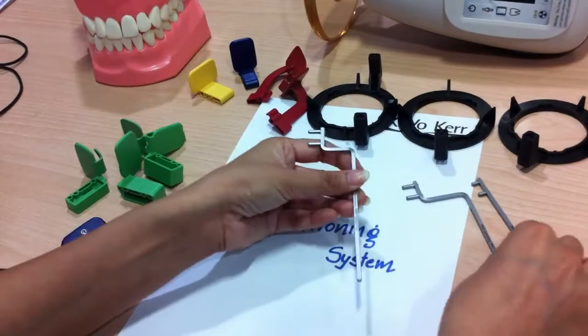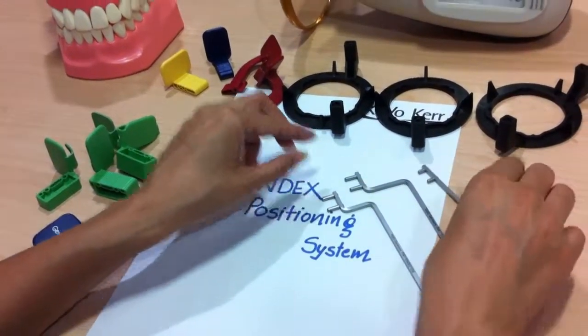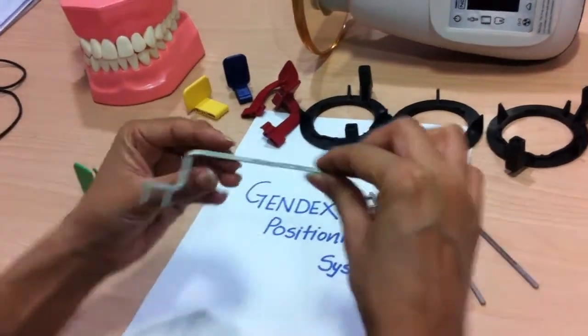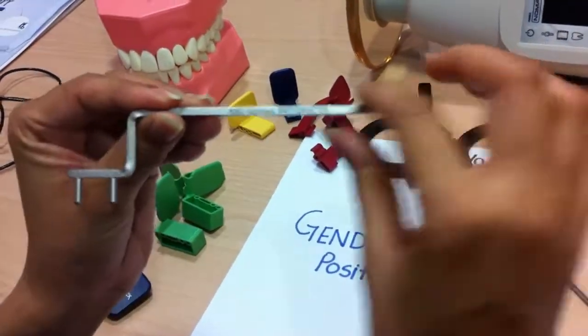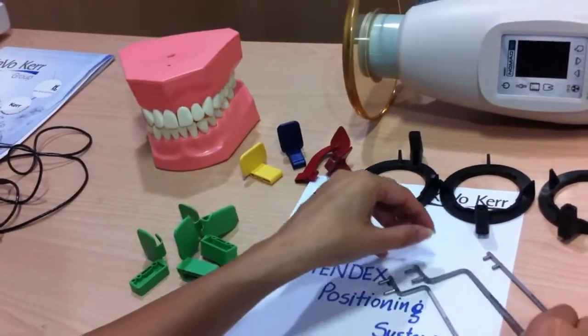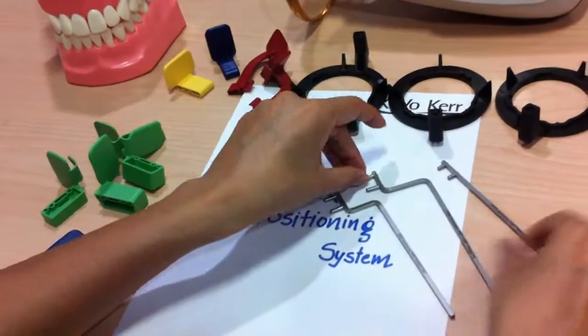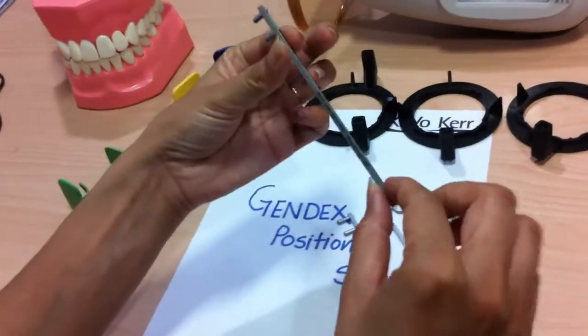You will get three different rods for holding the positioners. One is for endo, and it is written on the rod so there is no confusion. The second rod is for posterior and anterior scans, and the straight rod is for bite-wing.